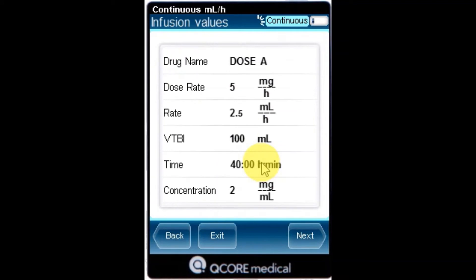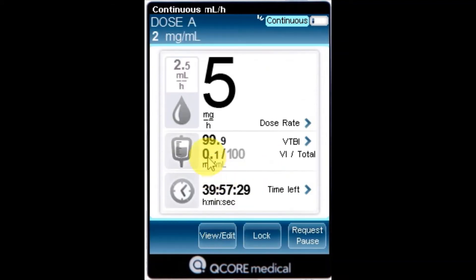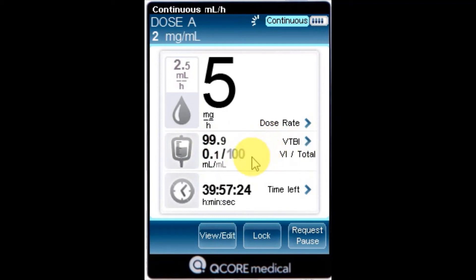VTBI: the total volume left to be infused during the current infusion. As the infusion progresses, this value decreases.